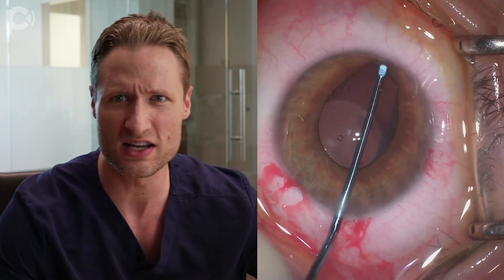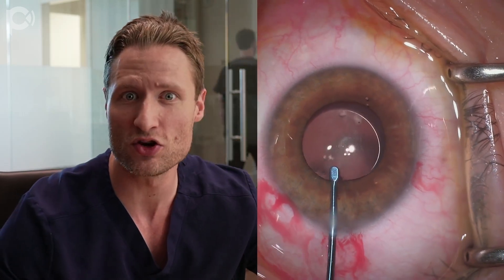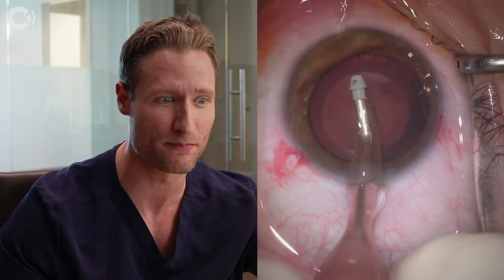Here I am tucking the haptics using the main wound rather than the paracenteses, because the angulation and manipulation through the main incision is so much more facile. Unless you're reckless, you're not going to inadvertently gouge the patient's natural crystalline lens. It's so much quicker and more efficient than wiggling through the paracenteses. If that's true, why do I make those incisions? I'll show you in the next example.